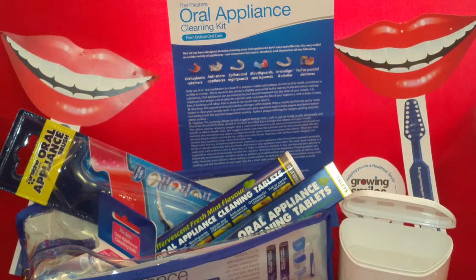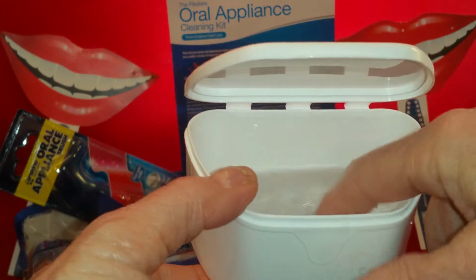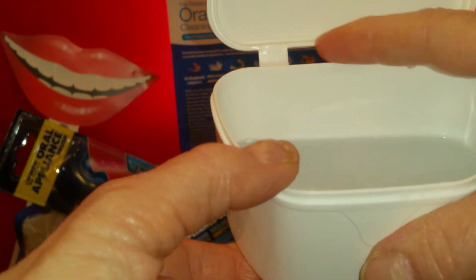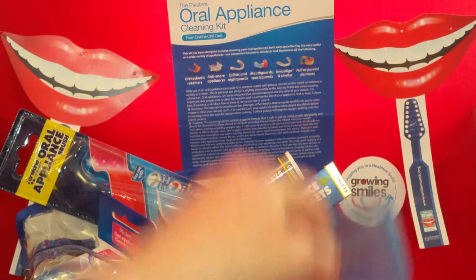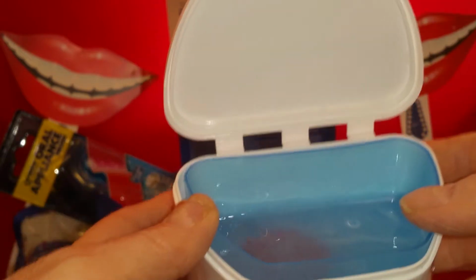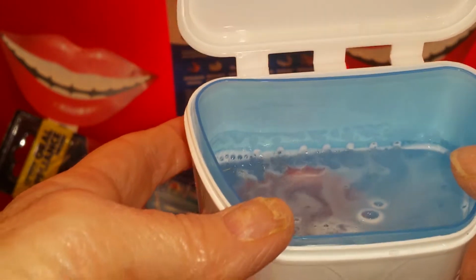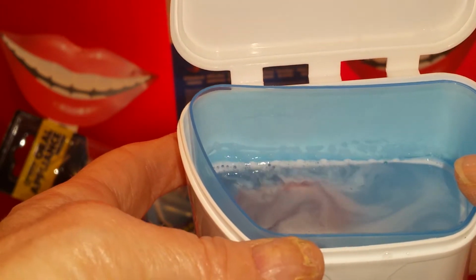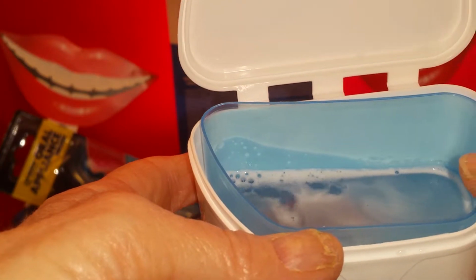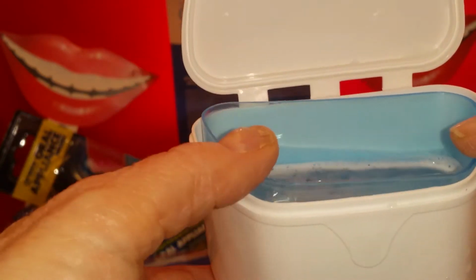What you want to do then is fill the bath with warm water, drop in one of the tablets, and what will happen is that will effervesce. Use finger warm water, don't go boiling hot, because that may warp and distort the shape of the appliance. You put your appliance in your little basket, like this, and pop it in there. Can you see how that's effervescing? That helps to loosen any debris that's on your appliance, whether it be a mouth guard, sports guard, night guard, retainer, orthodontic appliances, bleaching trays, whatever. You leave that sitting for about 15-20 minutes. You can leave it overnight if that suits you.